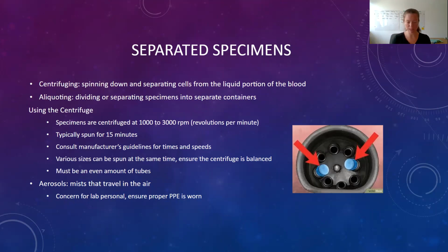Okay, aliquoting specimens. This is also something you may be doing. This is the process of transferring a portion of a specimen into another container. We have to pay attention to details when we're doing this.